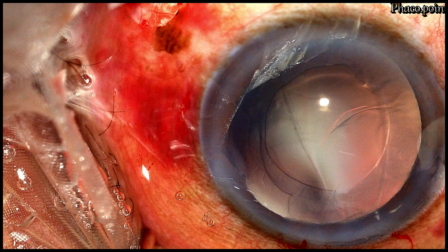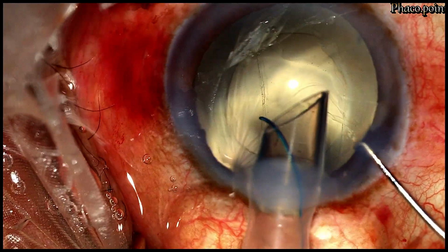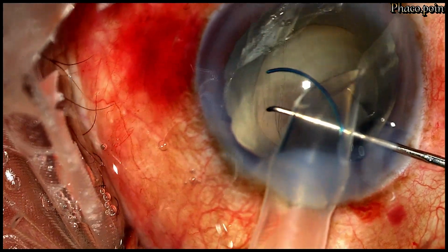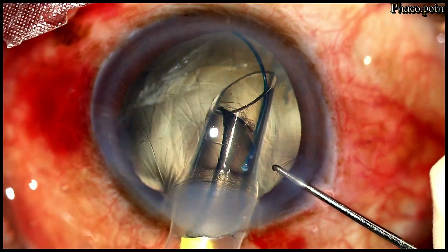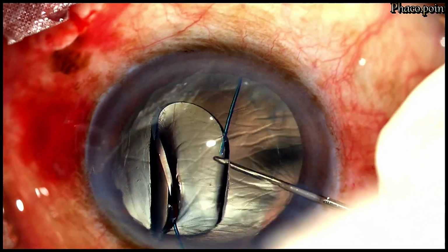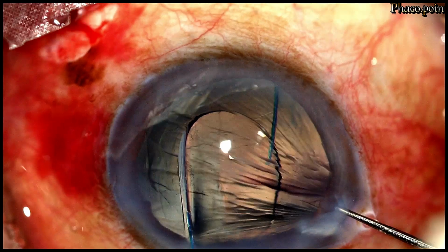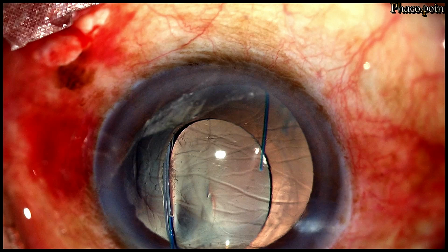Counter pressure and support to the optic are afforded by the Sinskey hook introduced to the right side port incision. I'd like you to note how the tip of the cartridge is introduced well within the anterior chamber so as to guide the leading haptic into its position in the ciliary sulcus, after which the rest of the optic is injected in the anterior chamber and the trailing haptic, as you can see, remains outside the eye.